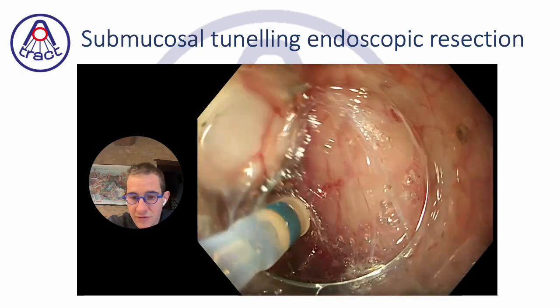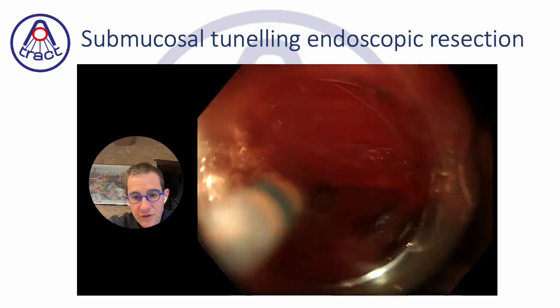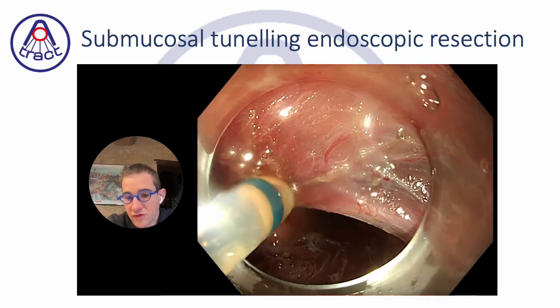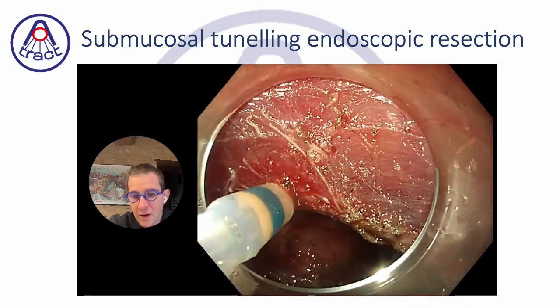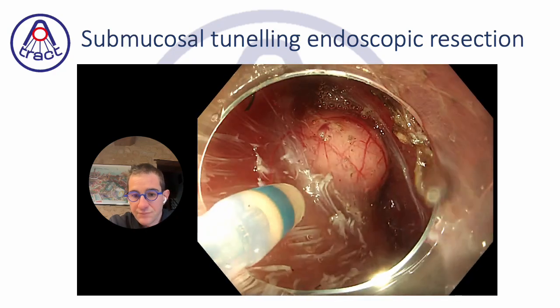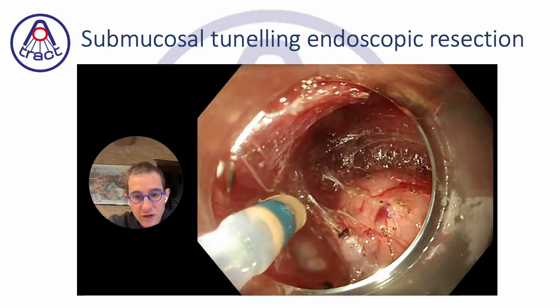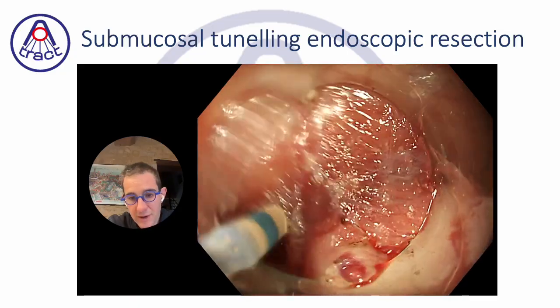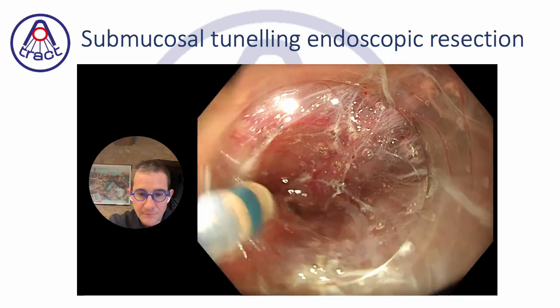If you begin to cut the muscle, the duration of the perforation is longer. So in our strategy, we prefer to begin with the mucosal side. We like to make the lesion completely free from the mucosal adherence. And then we will do the voluntary perforation after, when we have the impression that there is no more remaining submucosal fixation of the lesion on the anal side.